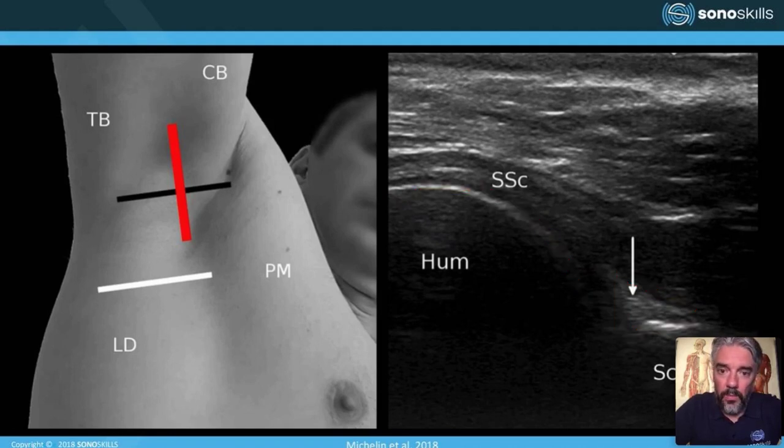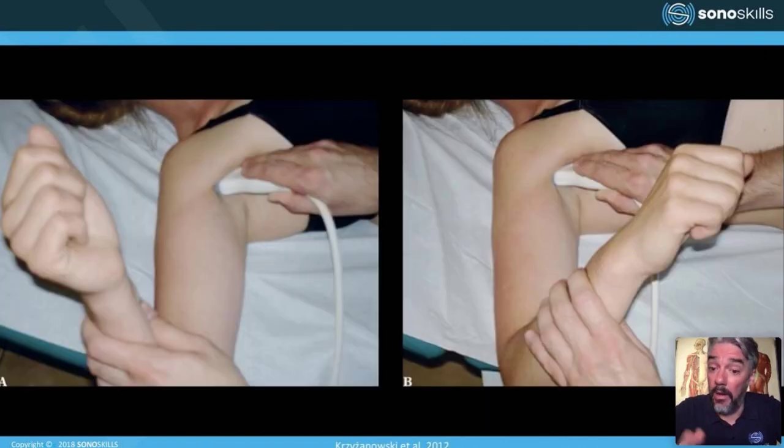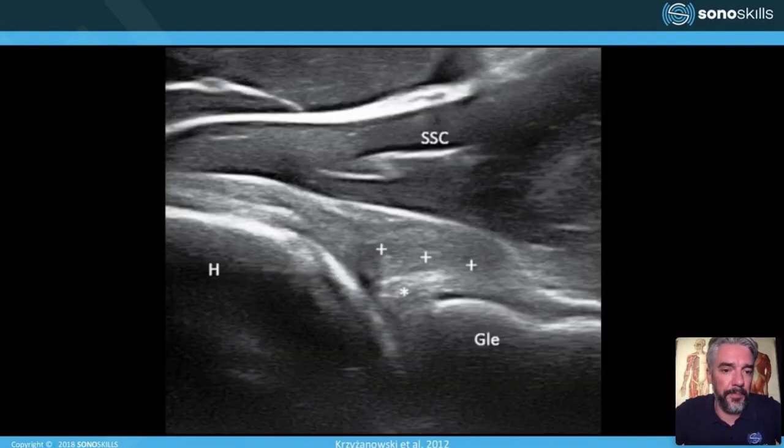So, and then again, you can dynamically check also the labrum movement patterns if you do ultrasound-guided clinical assessment. Like this, patient lies in supine, and then you can maneuver the arm while scanning the labrum. And this is what you want to see.